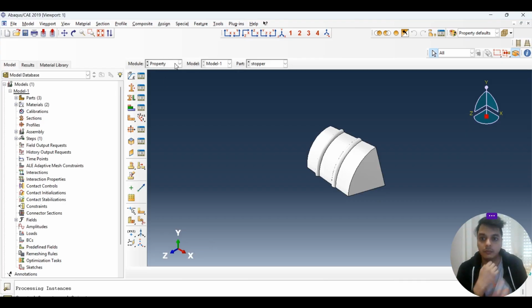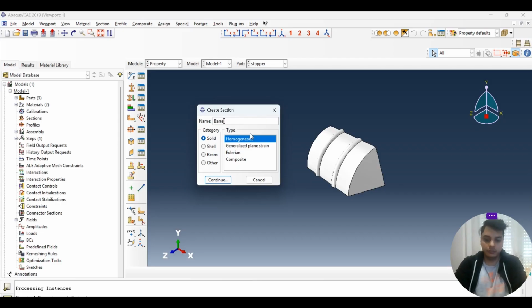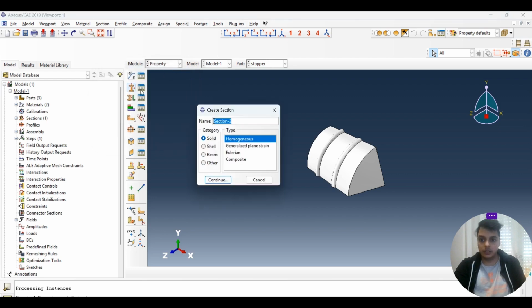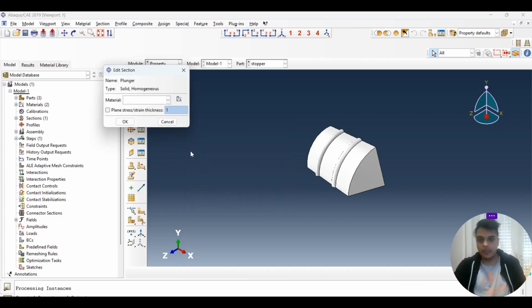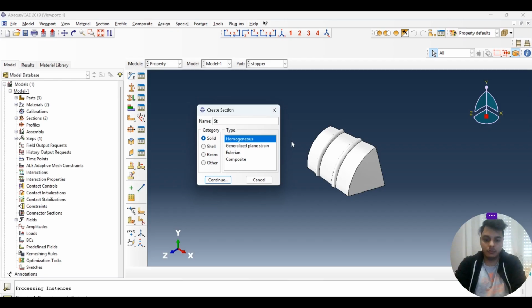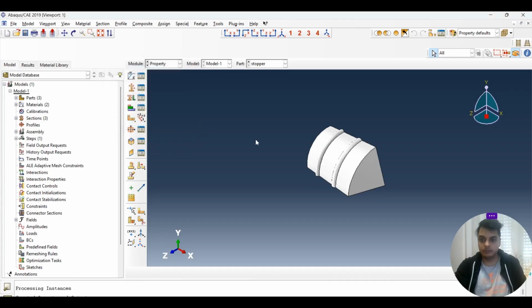Okay, so now what we have to do is go to the property. We have defined the property, and now we have to assign it to the section. So let's say one of them is the barrel, a solid homogeneous part. For the barrel I select ABS, all fine. Then another one is the plunger. For the plunger, we define again ABS. For the stopper, it's going to be the rubber material. So I define rubber. Perfect.